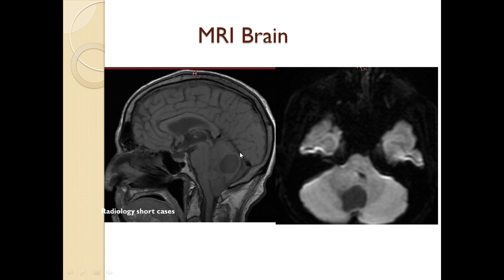This is a sagittal T1-weighted image. Pre-contrast, the cystic lesion is again seen in the cerebellum. However, the edema and mural nodule are not appreciable here. On DWI images, there is no restriction of the lesion as well as the mural nodule.